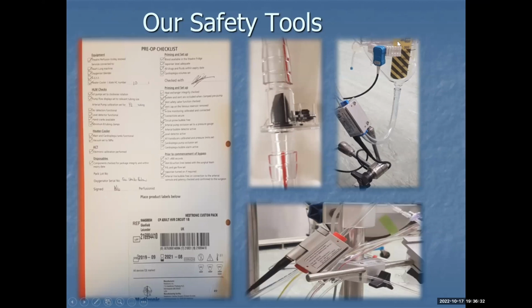So if our reservoir, that atrium, that storage of blood, goes too low, it will alarm just to warn us there's a problem. What could be a kink? The surgeon could be leaning on the line, because if we let this empty and we let our pump continue to circulate, it will eventually pump air into the patient.